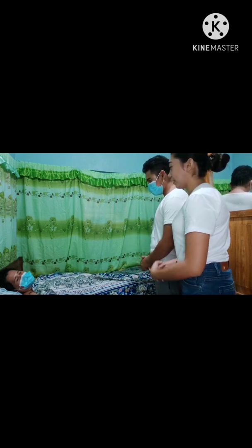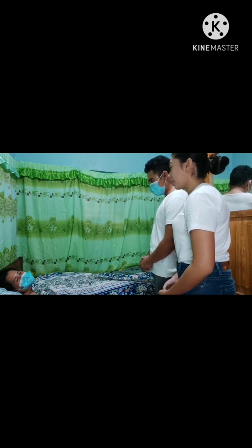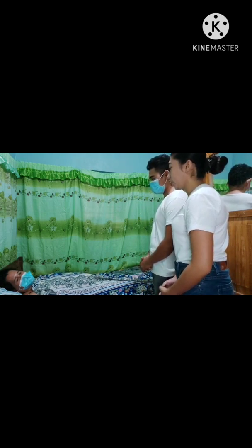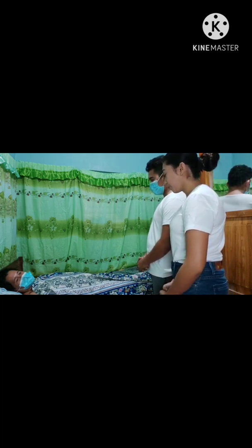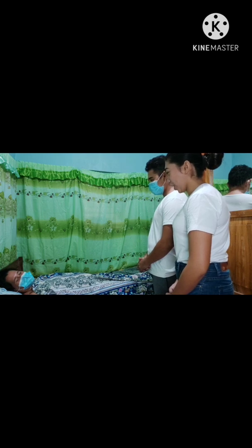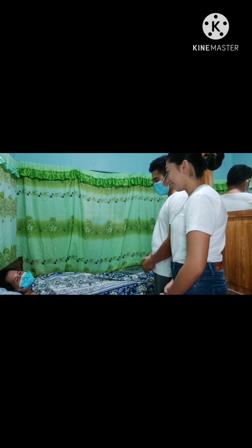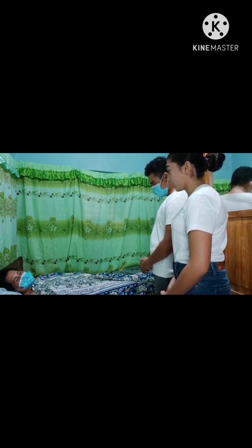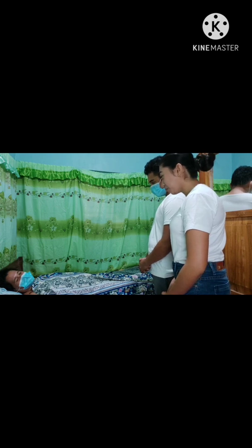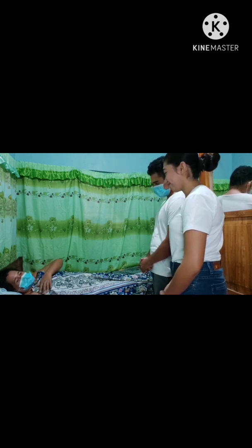Okay, so Ma'am Marites, by the way, I have received an order from the doctor today that we will insert an IV fluid to you because of the fluid loss that you have. Is it okay with you? Yes. Okay, that's great. So, first of all, are you left-handed or right-handed? Right-handed, ma'am. Okay, so is it okay with you that we will insert in your left arm? In my left arm. Yes.